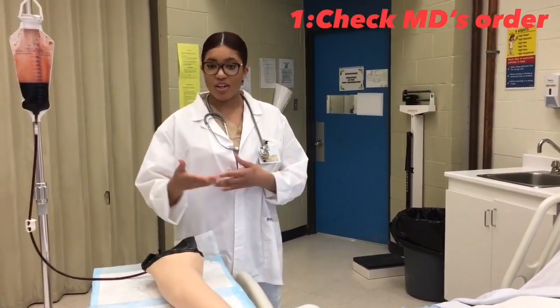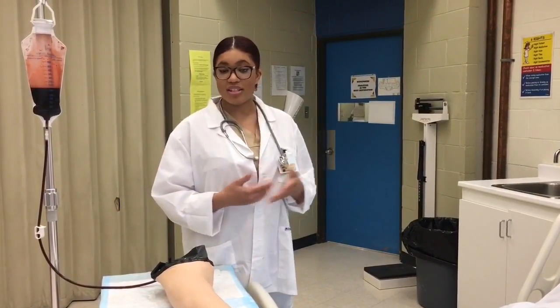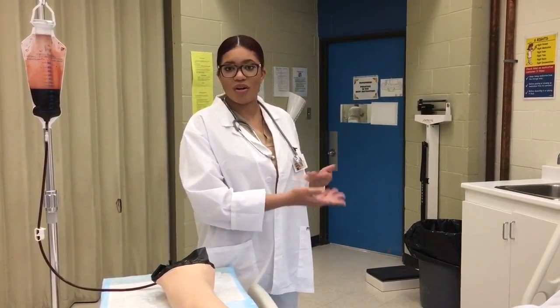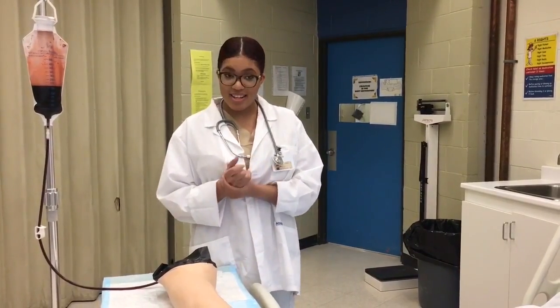The first thing you want to do is look at your doctor's orders to see why you're taking the blood, in case the patient asks you — you want to be able to explain it to them. So check your doctor's order, then come to your patient's room and hand sanitize.